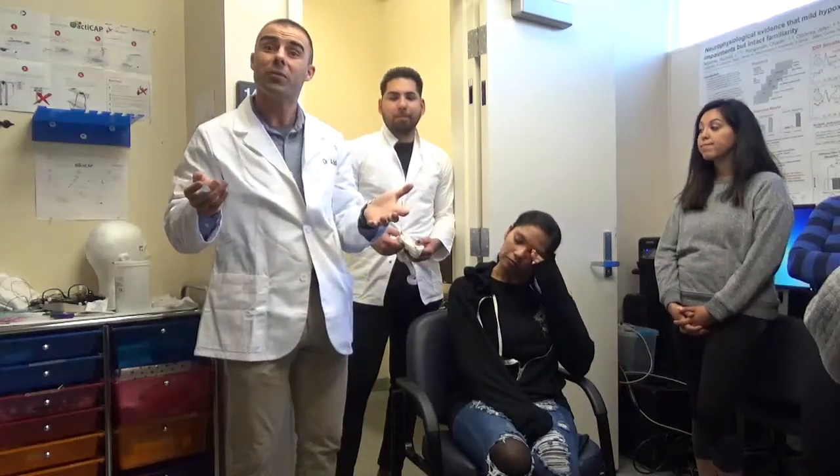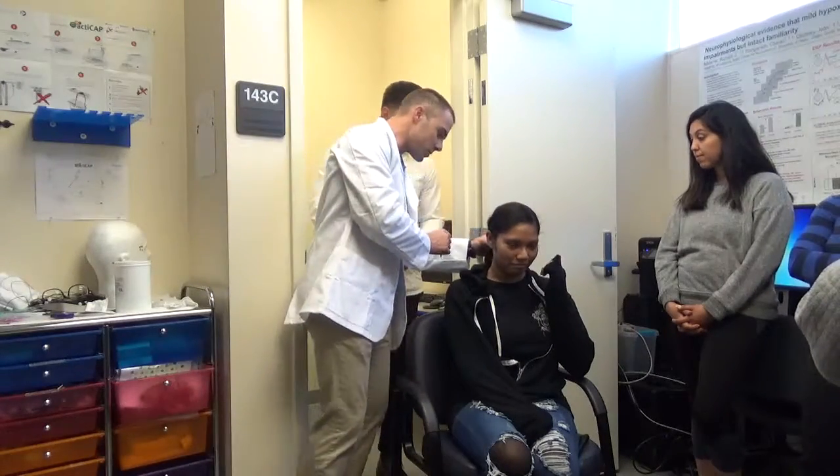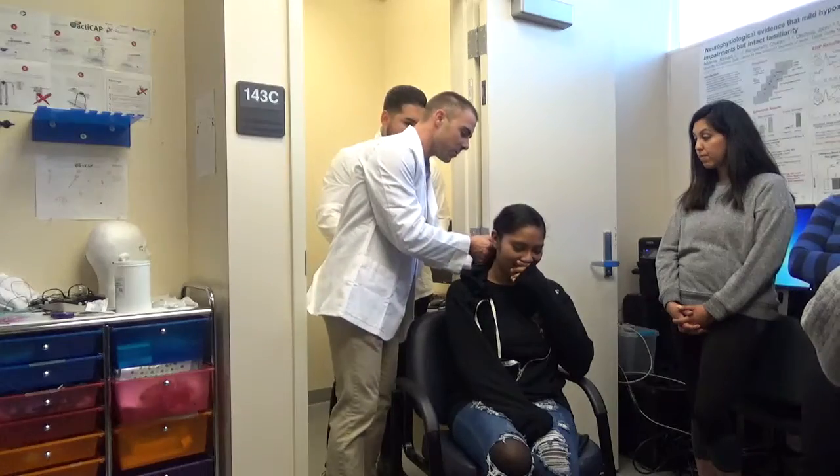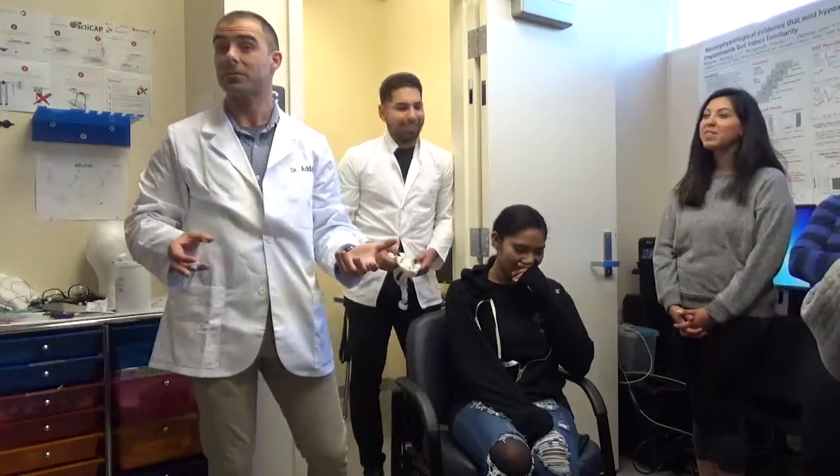And it works perfectly nice. But if it's a little looser, it kind of helps. So that's wonderful. And in fact, what I might even do, do you mind if I lower it just a little bit? Sure. Okay. So that works out really well. So it ends up being kind of like you're a hairdresser for a couple hours.